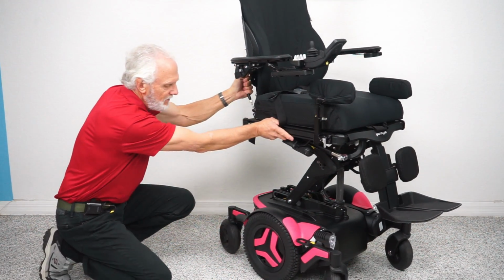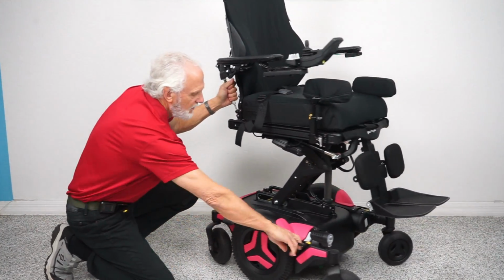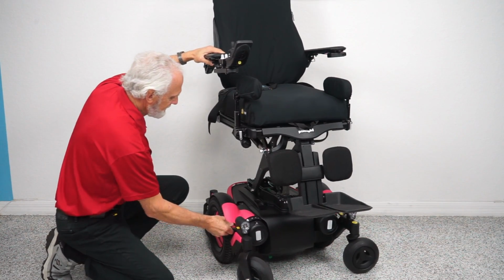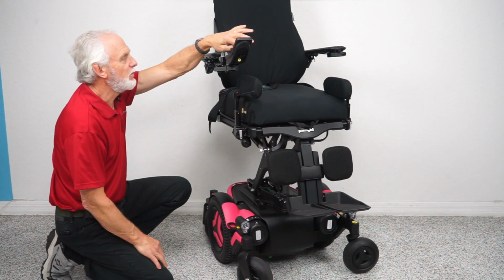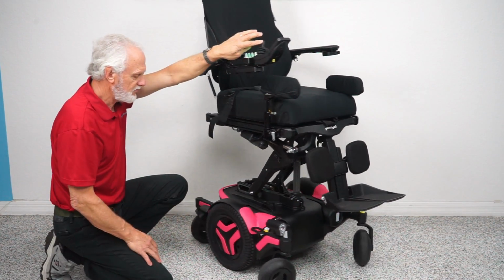As you can see, now you're in neutral. You can see the chair rolling on itself. Okay? When you're done, put it back in gear. Turn your power back on. Give it about 4 seconds to set up. Then you can start driving again.